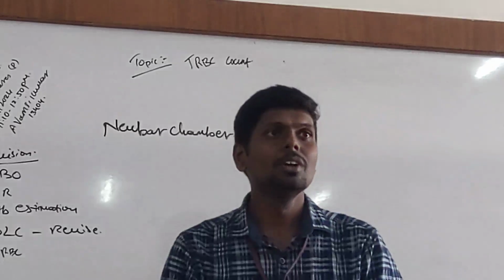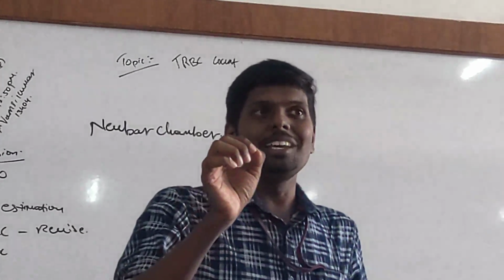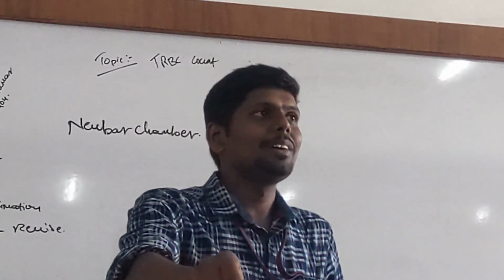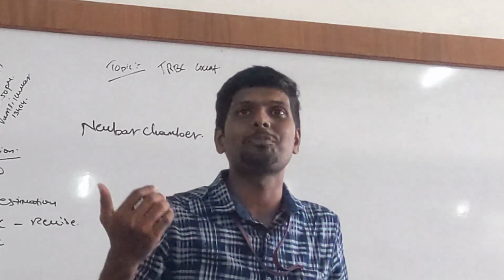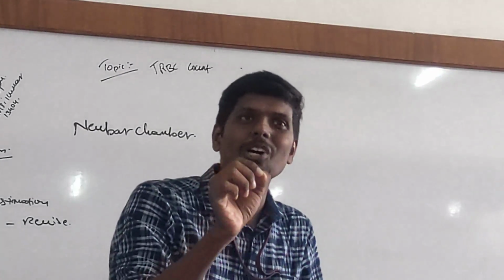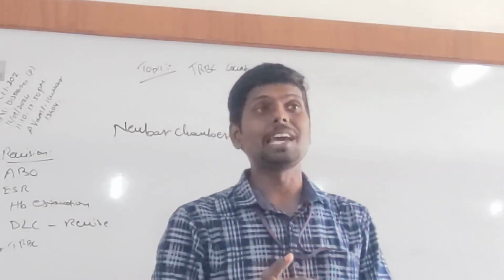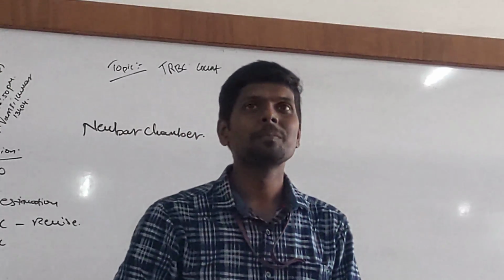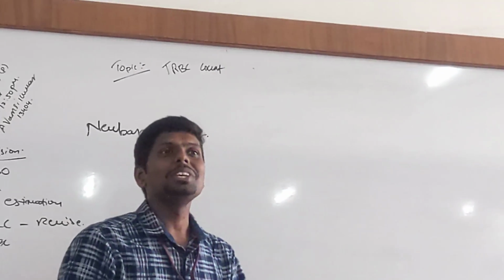That is the normal value. Now listen, isn't it ironic? Imagine I take one small drop of blood on a Neubauer chamber, count the cells, and decide the anemic status of 5 liters of blood. It's a very small sample, right? How is it possible? Can one drop represent 5 liters? Yes, sir.